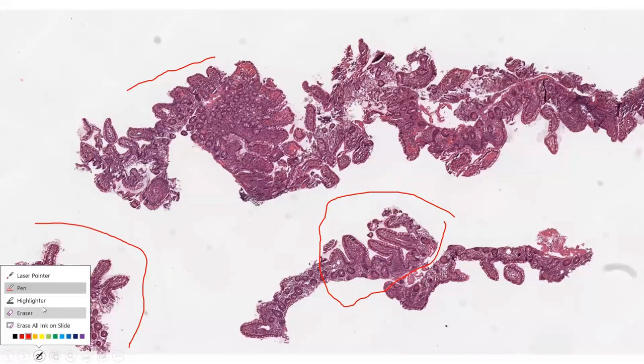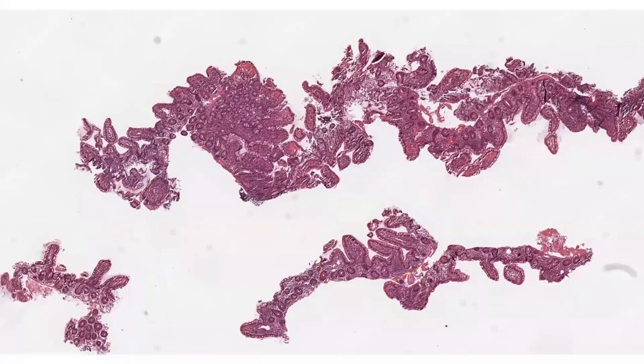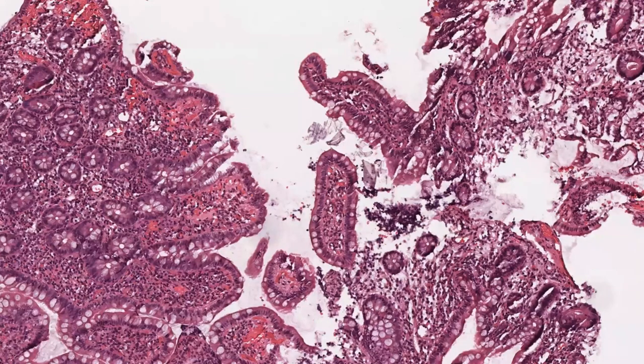then you do not have a lot of villi, okay? So the point is taken, yes, that we have some areas that the villi are gone, some are blunted and flattened villi, and some of them has got a very well-preserved villi. All of these for me, to my eyes, are all adaptive changes, okay? So providing that we know that, then we move on. I will just give you a close spot into this.